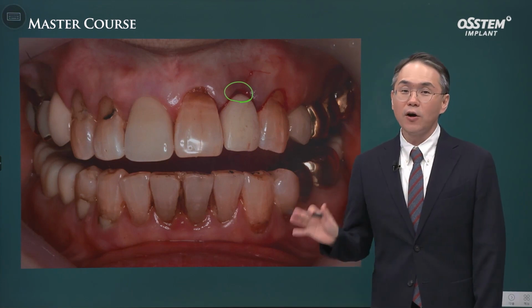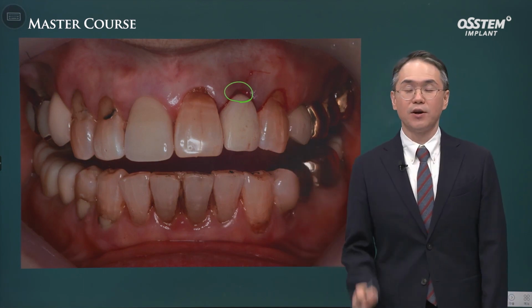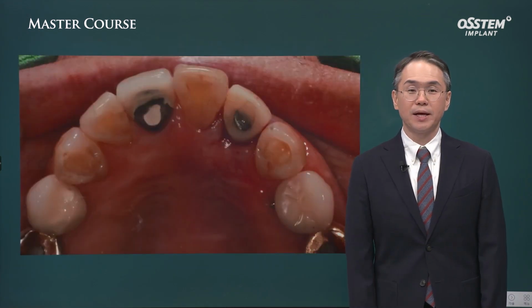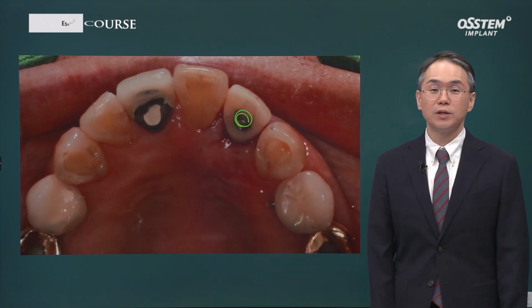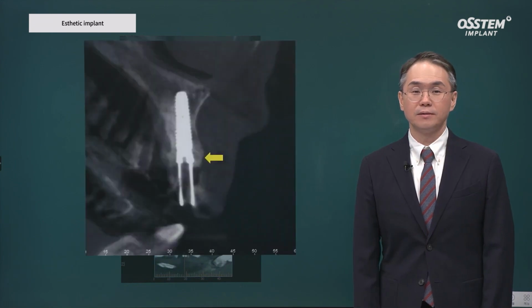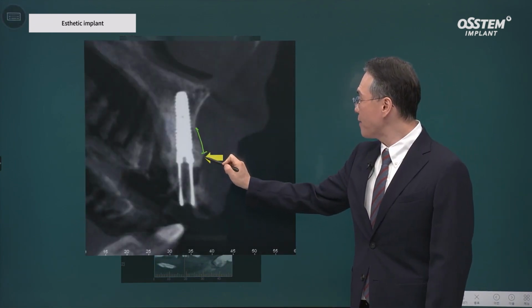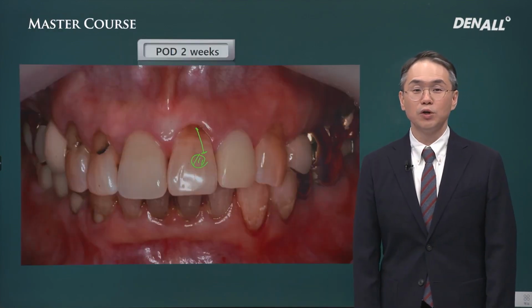There are many advantages. You don't need to do sutures, and the cervical contour that the patient had before extraction can be preserved. This is an occlusal view. A screw access hole is positioned palatally because drilling has been done palatally. This is the post-op CT. Graft material is up to the soft tissue level and not just the labial bone top. This refers to dual zone grafting.